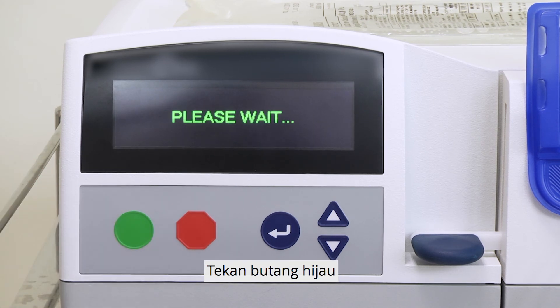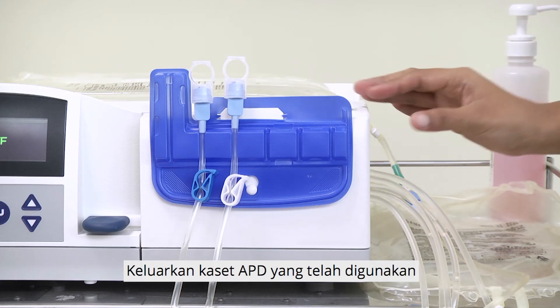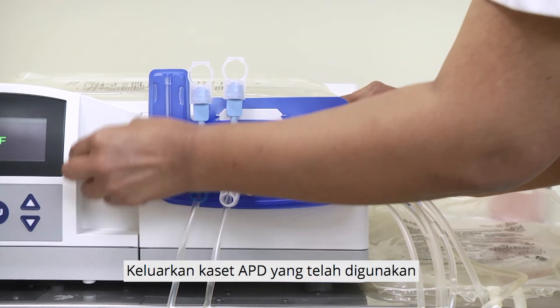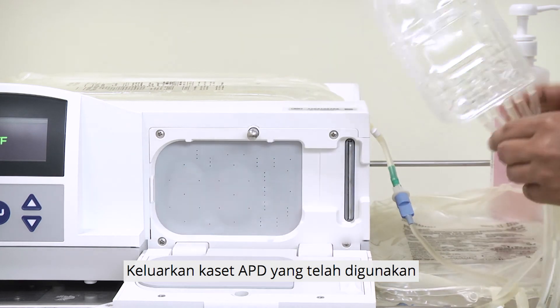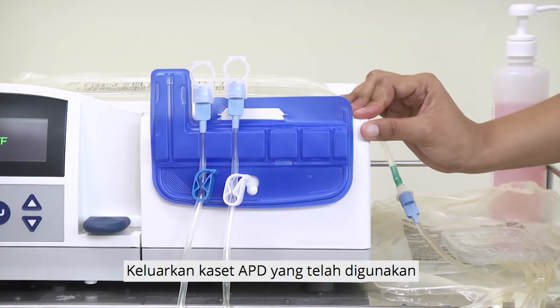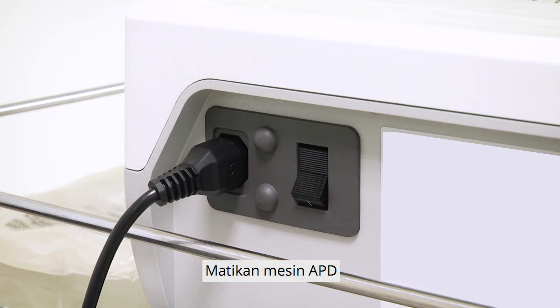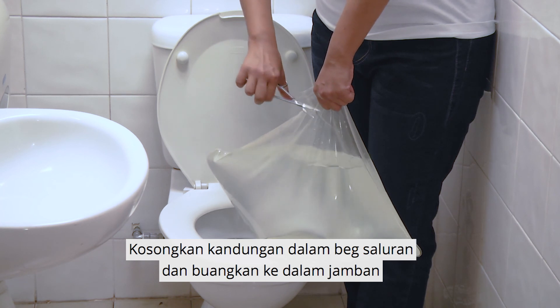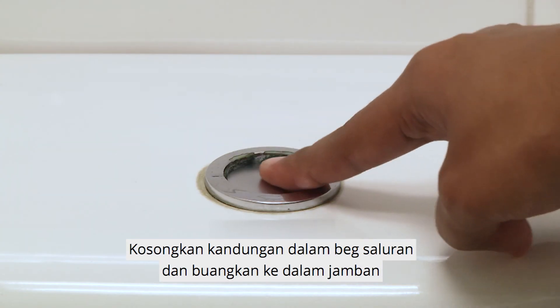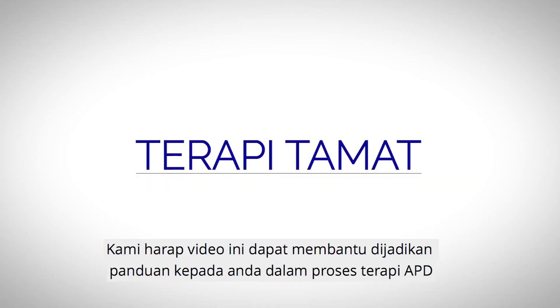Press the green button. The screen will show 'Please wait,' followed by 'Remove cassette.' Remove the used APD cassette. The screen will show 'Turn me off.' Turn off the APD machine. Empty the contents of the drain bag and flush it down the toilet. End of therapy — you have completed your therapy. We hope this video has been helpful in guiding you through your APD therapy.